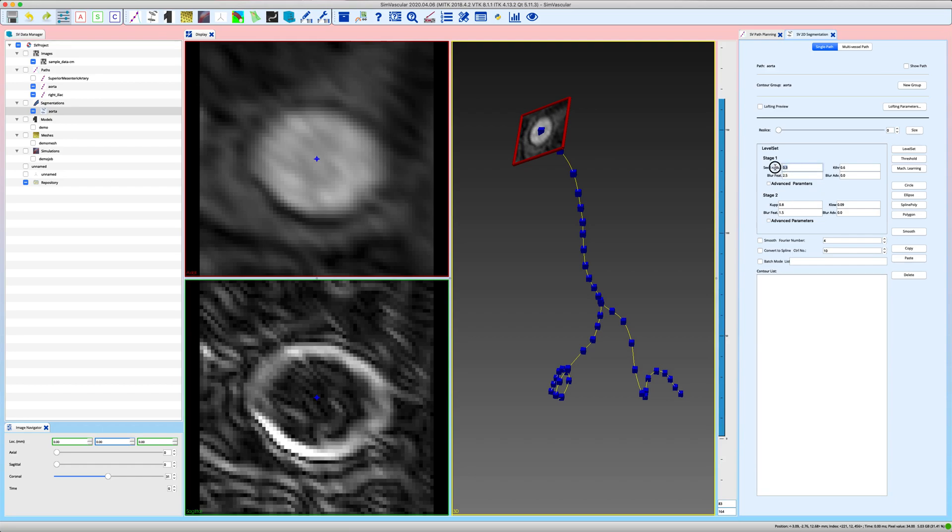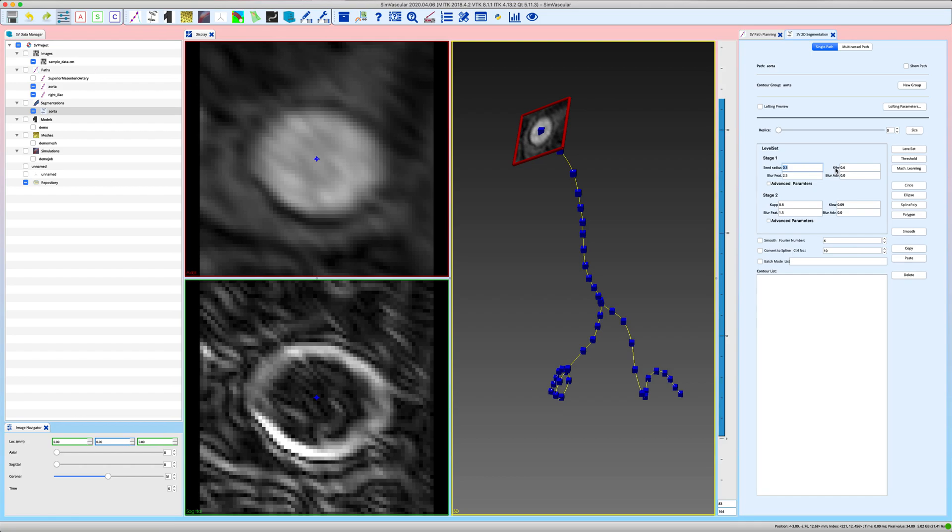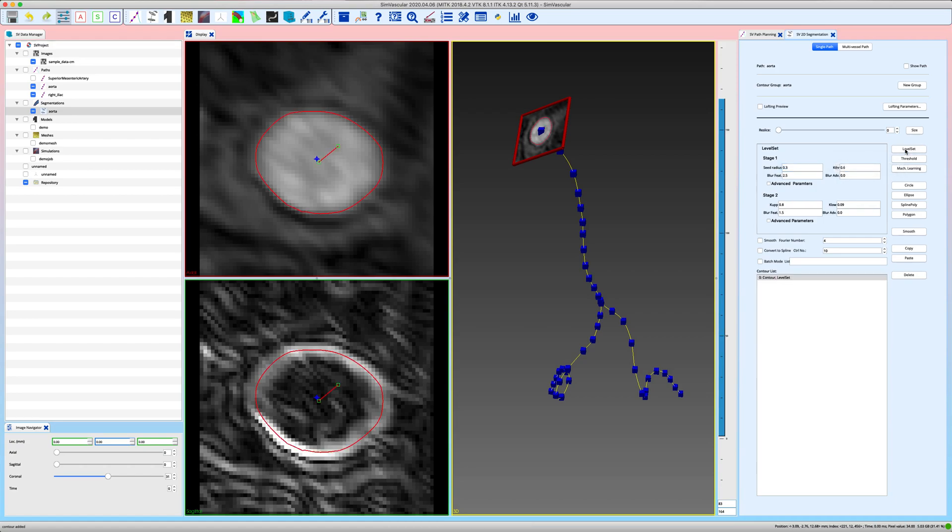The seed radius would specify the radius of your initial circular sphere in the 2D window. So if your vessel is not really small you usually don't have to change that, and all the parameters that start with a k prescribe the allowable curvature of your final segmentation. I can show you an example, but first let's use the default set of parameters. Just click on level set again and the resulting 2D segmentation that is found is this one over here.